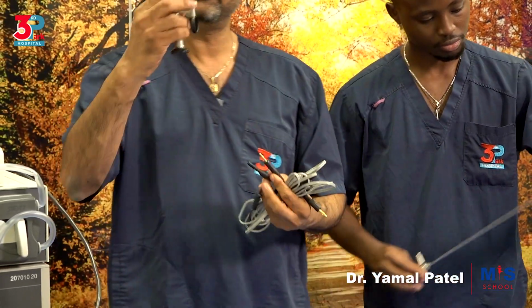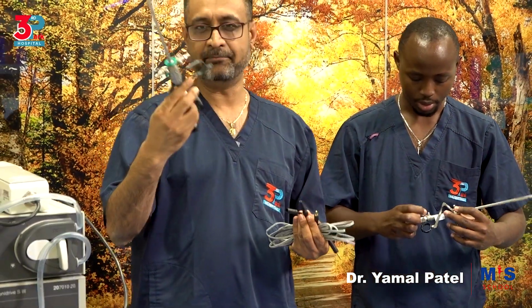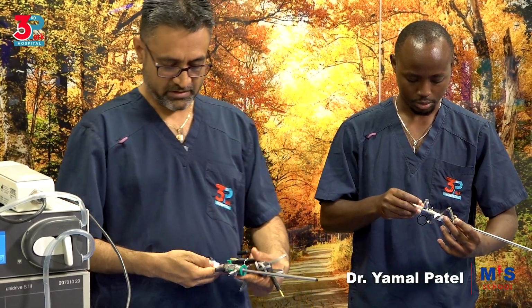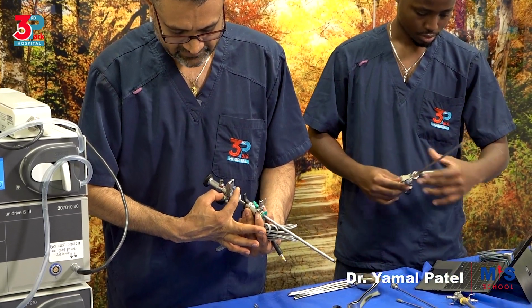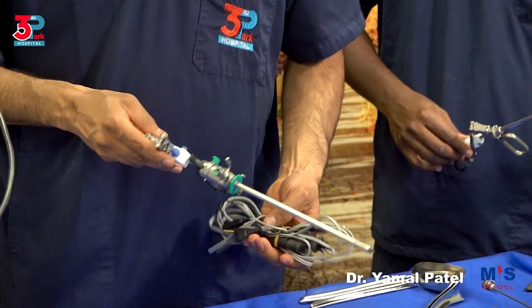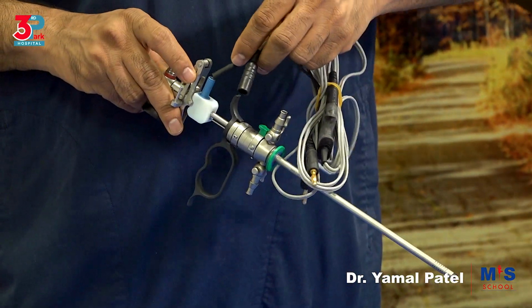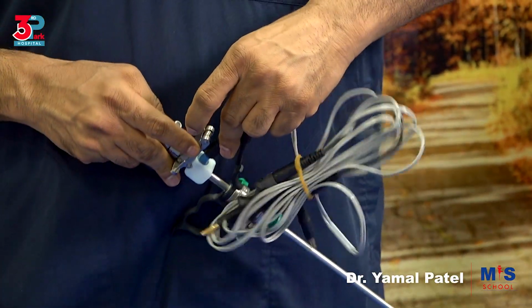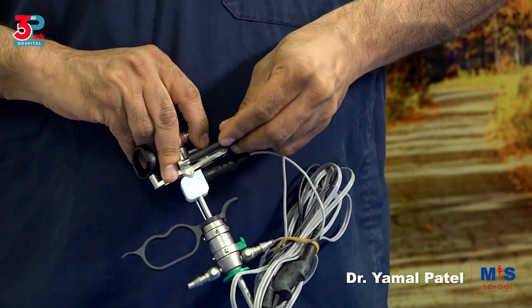With that, this resectoscope has the ability to do both monopolar and bipolar resection. So you will see when it's bipolar, it will have two electrode connections, 1 and 2, where you will have these two connect. Let's say this will connect here and this will connect here.